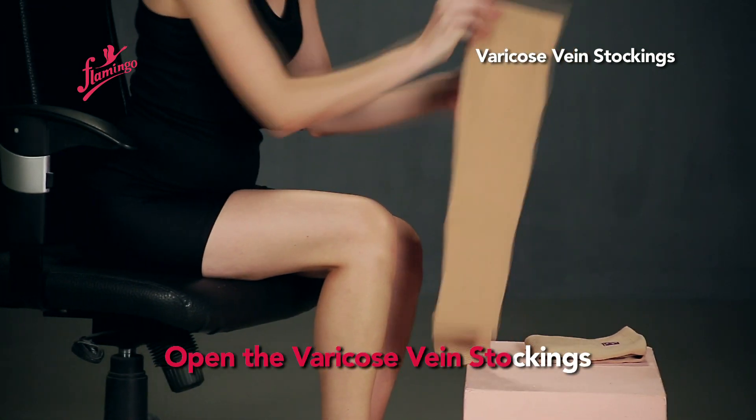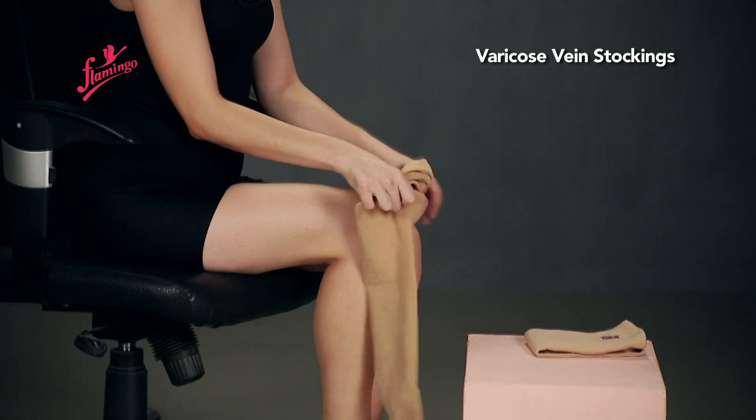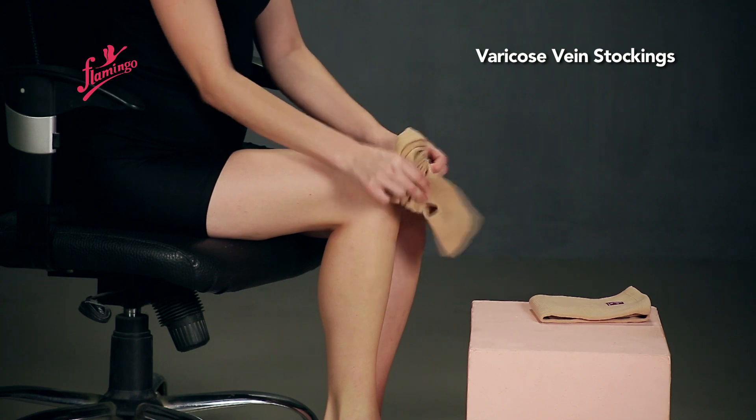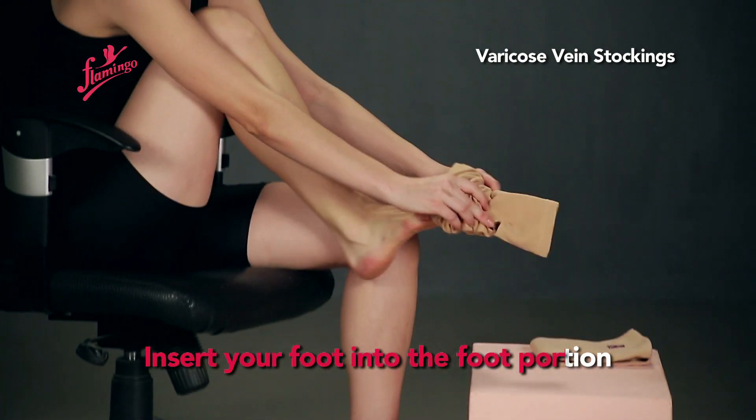Open the Varicose Vein Stockings. Insert your foot into the foot portion.